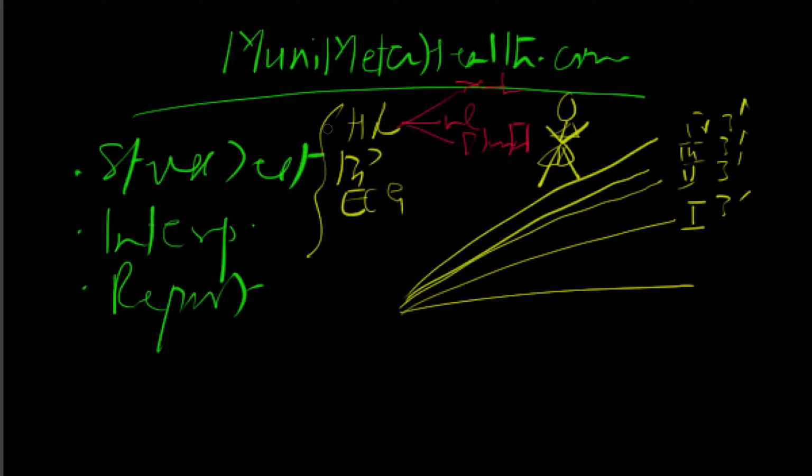Having said that, these are the parameters: heart rate, blood pressure, ECG, and then of course the symptoms. Very important. You follow the symptoms too. You like to see if the patient is starting to develop any chest pains, because ultimately the patient is referred from an internist and now is in your lab.